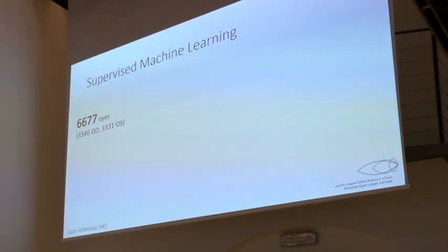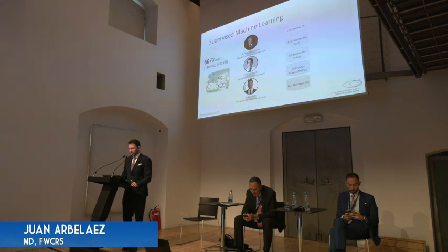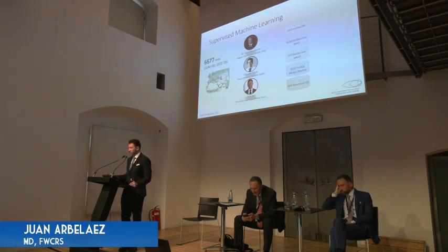We included 6,677 eyes that were collected in 3 different locations, Oman, Saudi Arabia, and Spain, by Dr. Alal Dansuri, Jorge Alio, and myself. We reviewed and agreed on all of these 6,677 topographies, and we classified them into 5 different groups: normal cases, keratoconus, borderline cases, post-op myopia, and abnormal topographies. We agreed to select only the scans on which the 3 of us were in agreement.